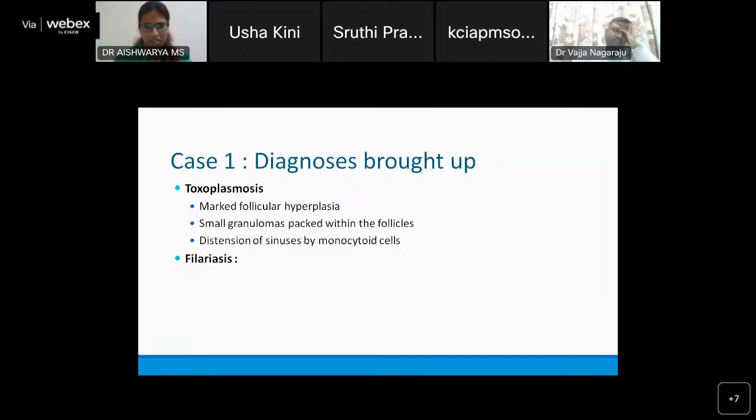Okay. Another point is in filariasis, if they are dead, that is when the reaction really happens. So we did not find eosinophils. You find them all calcified, so-called lifeless. But I don't think it is filariasis because there is no such morphology to it. Though there was a little fibrosis at the end, I'm sure it is not fitting into filariasis. MAI infection. Someone thinks it could be tuberculosis with intracellular atypical mycobacteria.